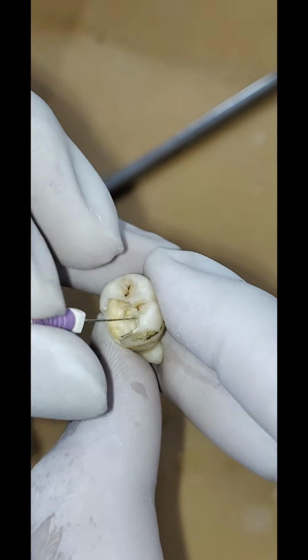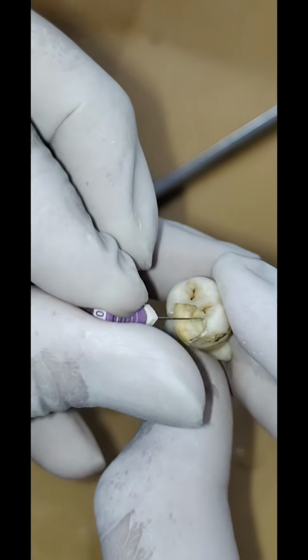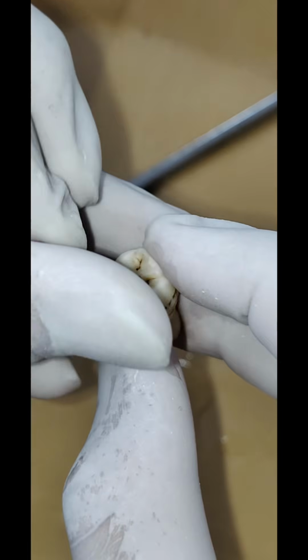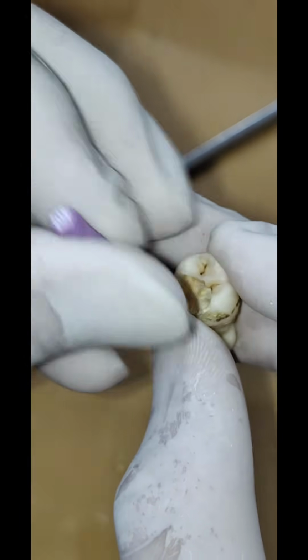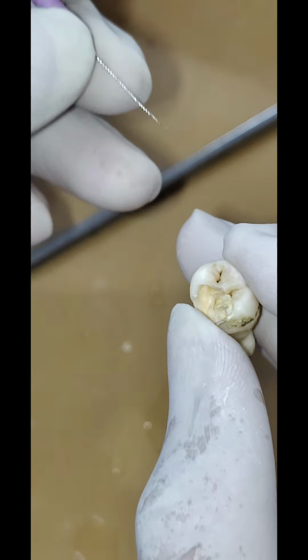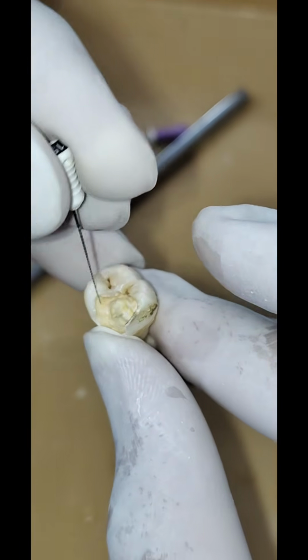I'll speak about the negotiation in the upcoming videos, but for today, we are more concentrated on the access opening. And while I remove this file, observe the worn off flutes in the file. When the file looks like that, it's time to discard those files and go on with a new one.